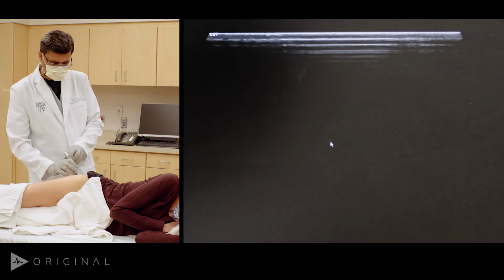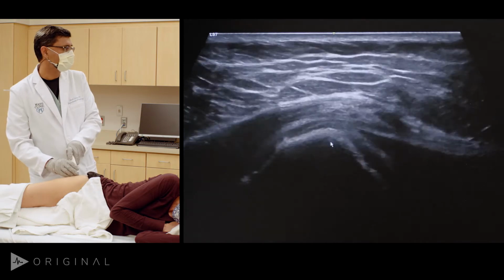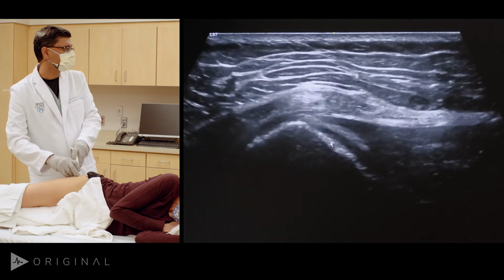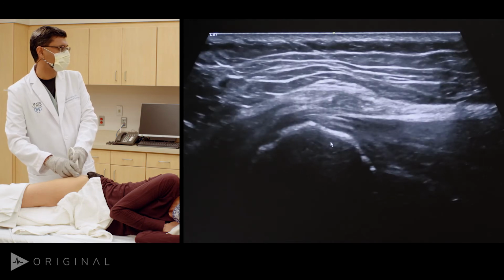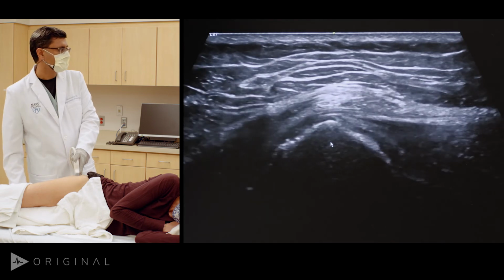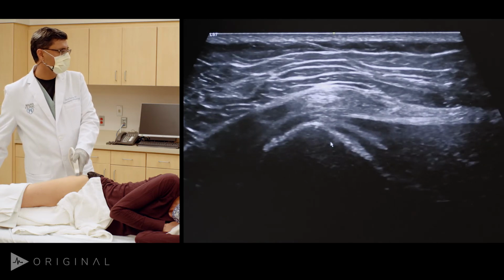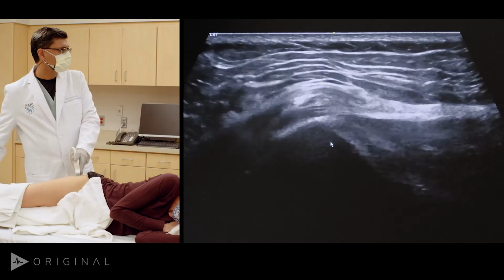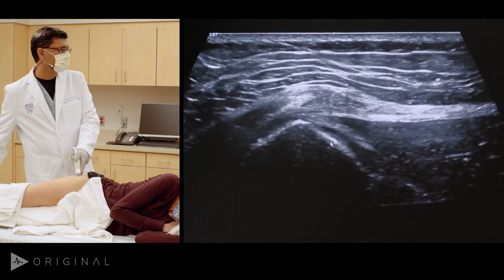So now, once we've looked at the intact gluteus minimus and medius tendons, we go back to the midline and we try to find our triangle again. Because what's our intention? Now our intention is to look at what's happening to the iliotibial band. The way to differentiate where the iliotibial band lies is by making simple movements of the legs. So here, I'm holding her from the ankle, I'm going to abduct. And see, the moment I do that, what's happening? That iliotibial band is sliding over the gluteal tendons.